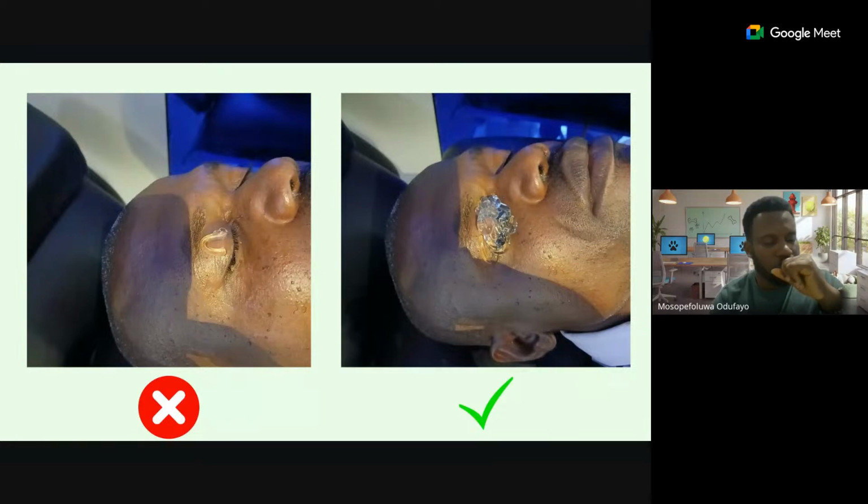But if you're putting this small amount of gel, what you eventually end up doing is putting pressure on the eyelids, and that pressure is transmitted to the globe and compresses the globe. In that instance, many times you will get false axial diameters because now you have a flattened cornea. When the cornea is flattened, it reduces the axial diameter, and so you get false axial diameters.